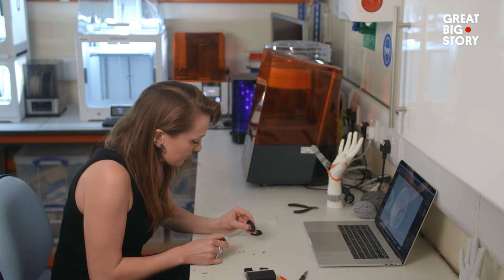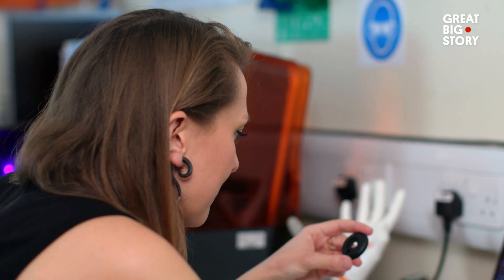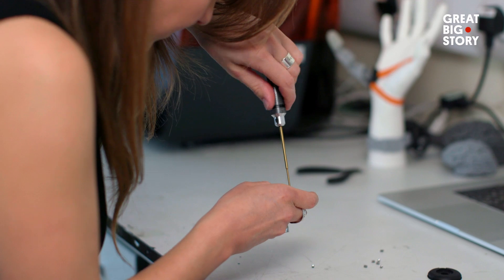How did Dani start working on the Third Thumb? I've always been interested in designing for the body — I think that's so much more interesting as a product designer. It wasn't until my master's at the Royal College of Art that I really started exploring prosthetics.